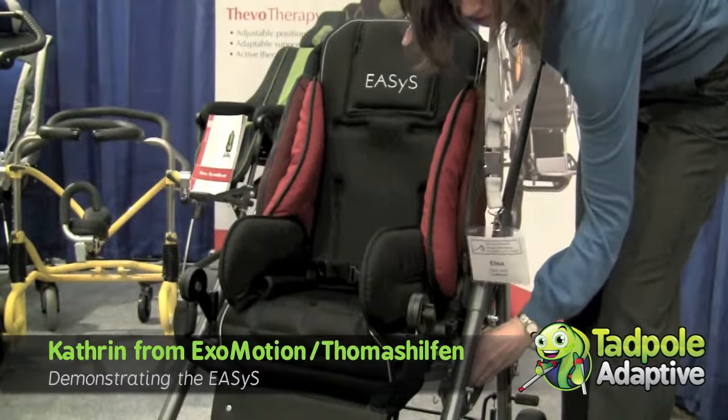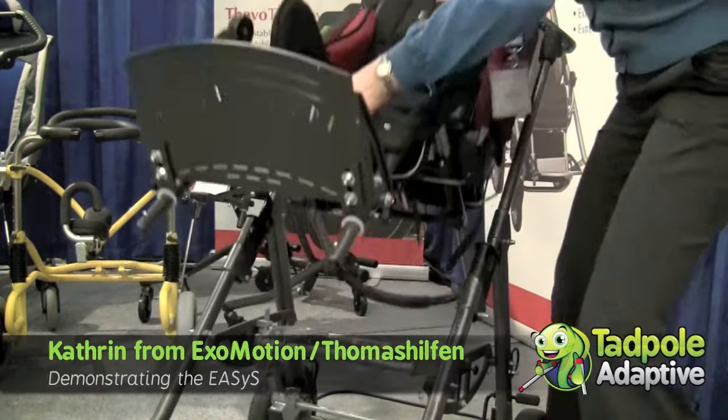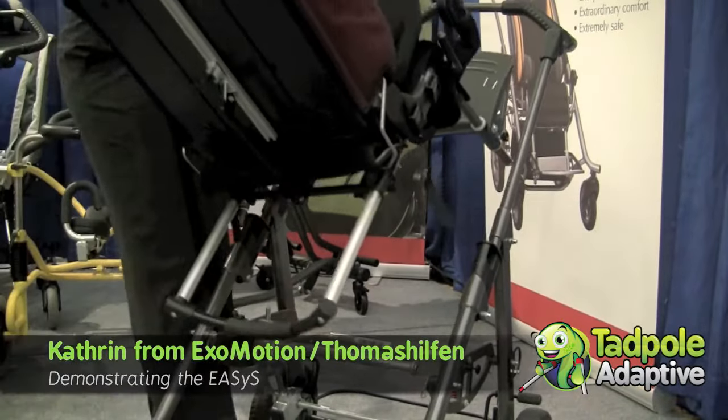It's very easy to change from facing to the front and then facing to the mother or the father.